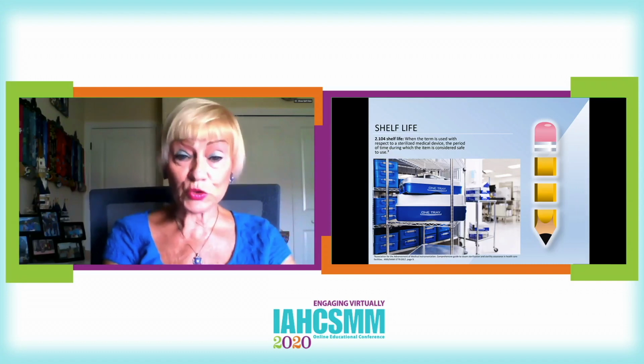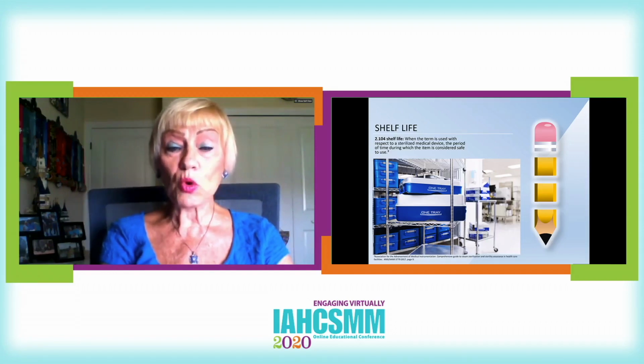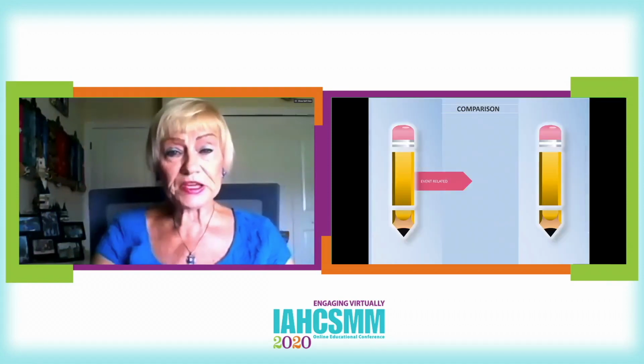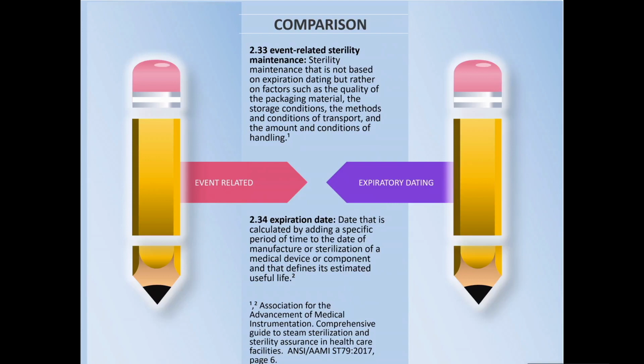Now, when I first went into the OR, there was no such thing as event related. Everything was expiratory dating. So let's look a little further into those two concepts, and let me do a compare and contrast for you. So we'll talk about event related, and we're going to talk about expiratory dating. Event related sterility maintenance is not based, it says it right in the definition, on expiration dating, but it actually takes into play factors concerning how you store it, the quality of the packaging material, the methods and conditions of transport, and the amount and conditioning of handling.